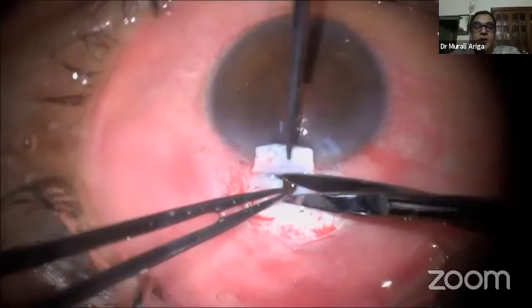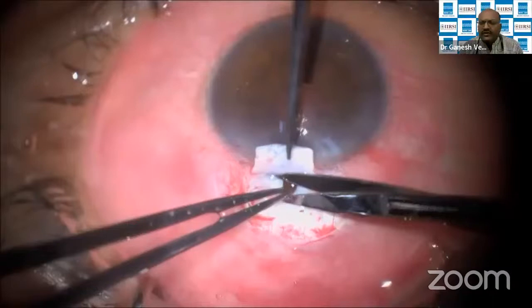I think another important point here is to hold the flap very gently and avoid a toothed forceps. Sometimes you see beginners holding the flap with the toothed forceps or even the microtoothed kind of forceps. Best is to avoid a toothed forceps to hold the flap. Otherwise, you'll be making small buttonhole kind of holes in the scleral flap itself. So use non-toothed forceps. I think you could use a serrated forceps. A tying forceps, non-toothed, will not hold very well, but you can use a serrated forceps to hold the flap.